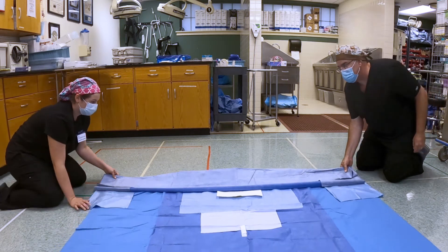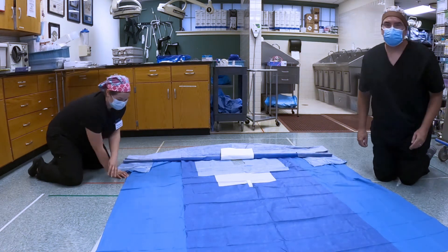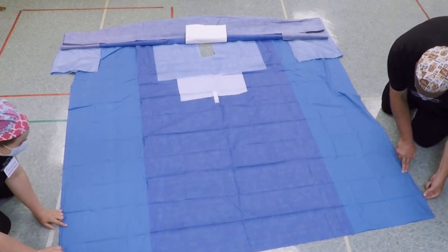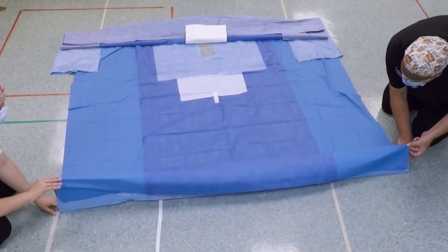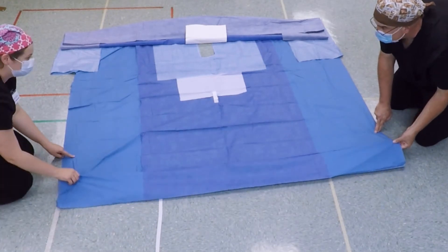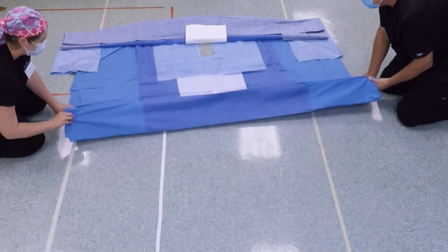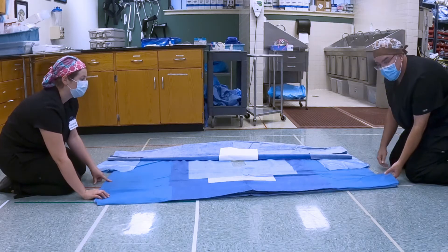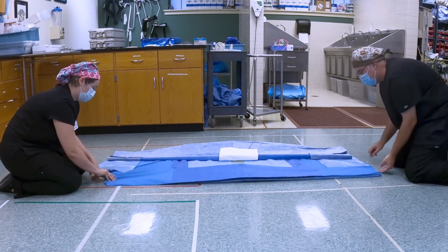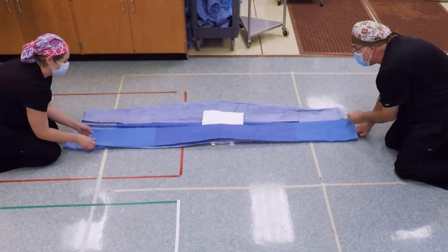Now slide this all the way forward so that we have room, then at this end we're going to do exactly the same thing. Finger here, flip it up and over. Pulling against each other — up and over, pull against each other, up and over. We'll do a little one here, just follow these folds, and then one more that will bring us up to meet our other piece.